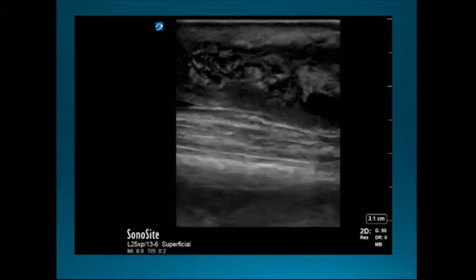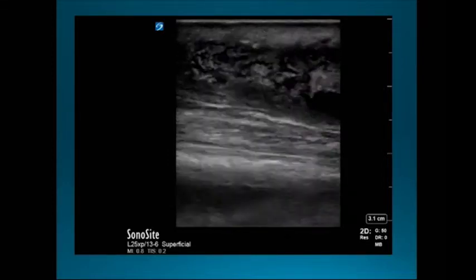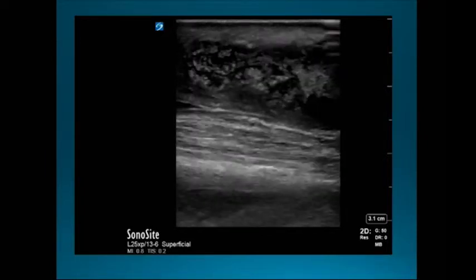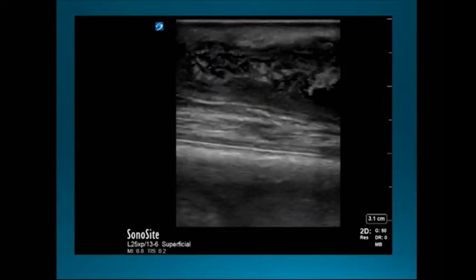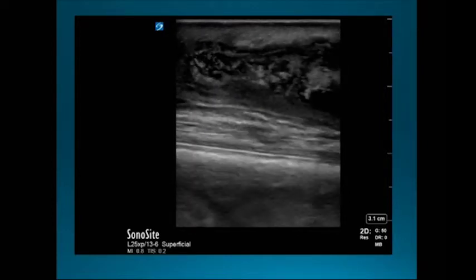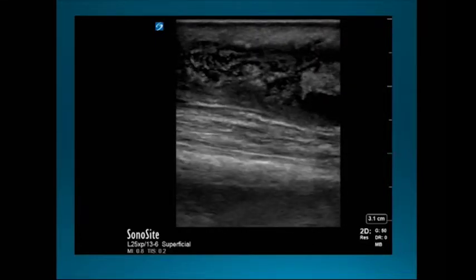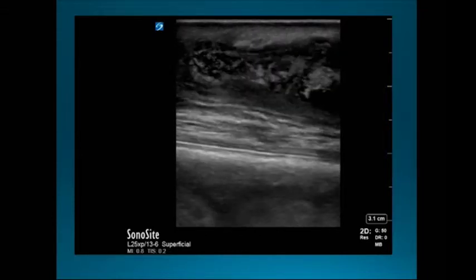This tract from here all the way up to here, right? And so had I done the I&D just where that area of fluctuance was, then I would have missed the fact that he's got a surgical problem. I'm not the droids he is looking for, right? And so I can't do just an I&D of this in the clinic. He needs to see a surgeon. So that's helpful there.